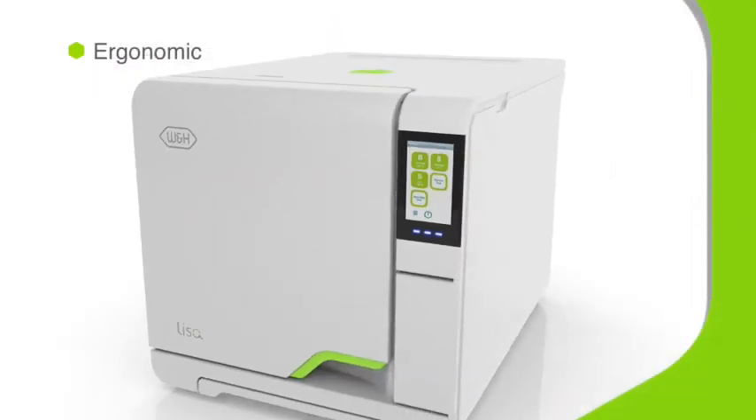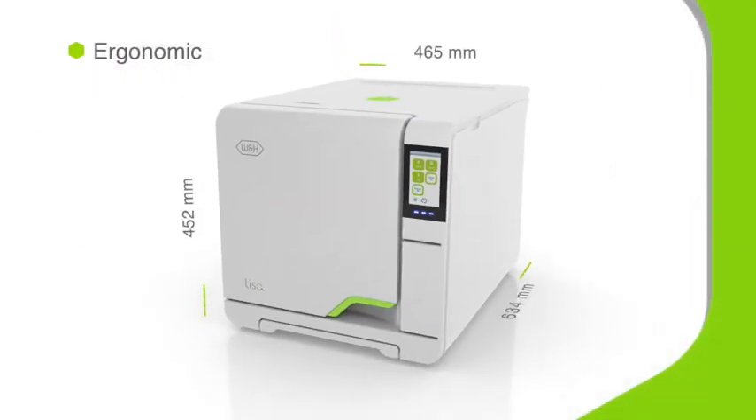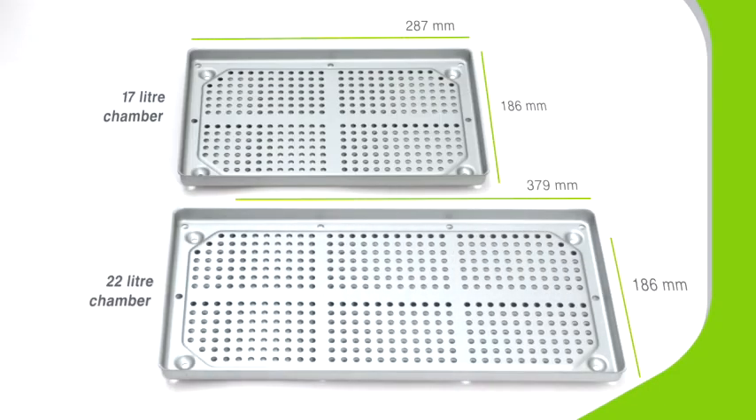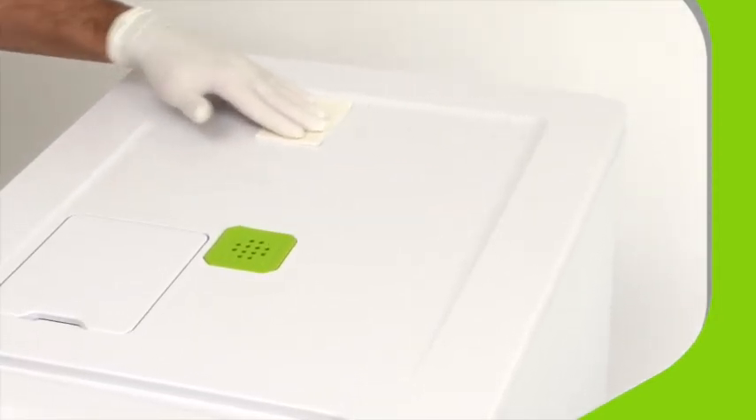The Lisa VA-131 vacuum sterilizer is ergonomically designed. Modular feet help it adapt to even the narrowest workbench, and a choice of size for internal chambers provides for different needs. Smooth external design with minimized apertures makes Lisa very easy to clean.